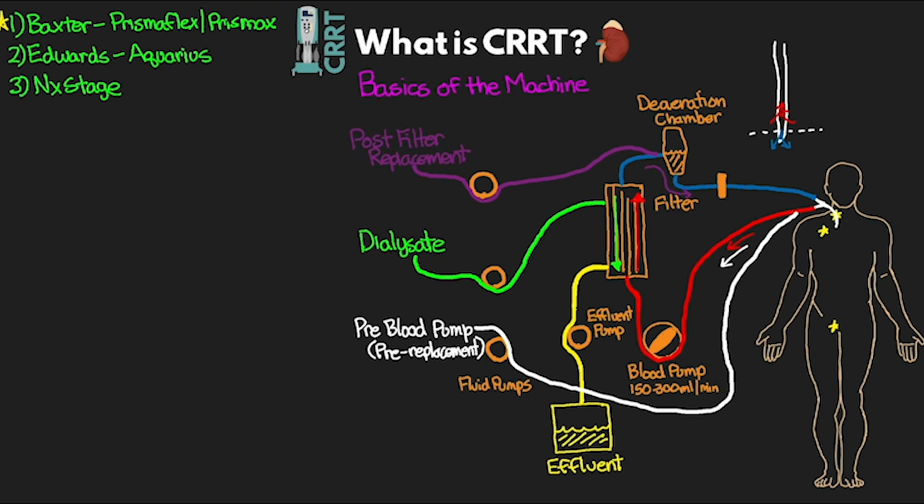Now, when we talk about these different replacement fluids and the dialysate, there are many different types of solution that we can use for these fluids. We do have pre-made solutions that have particular balances of electrolytes and bicarb, or your pharmacy can mix up special bags, or you can even use some standard fluids in certain cases. Again, I'm going to discuss some of those differences on when and why you would use them in later lessons in this series.